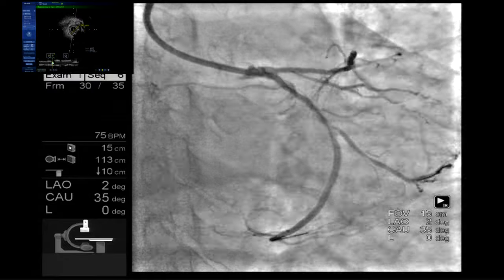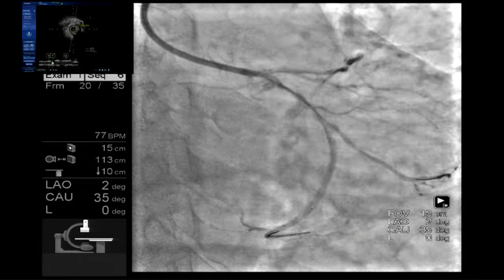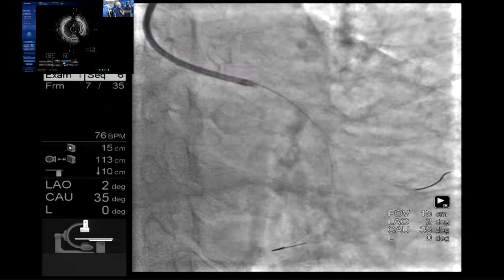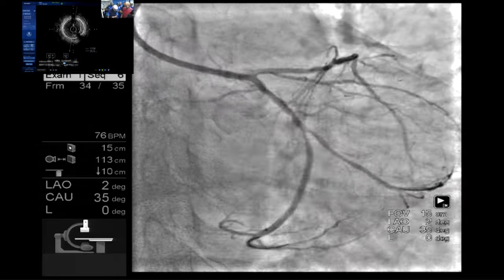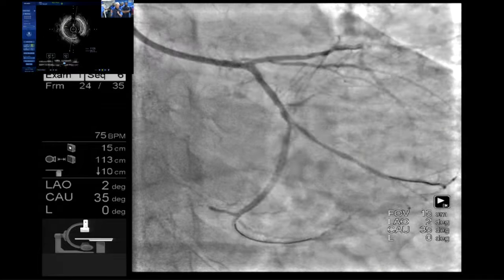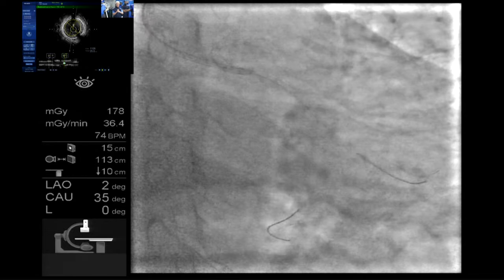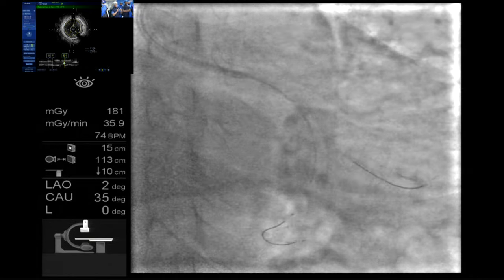EM, right. Would you start with a 2.25 because the rule is to go a quarter size down? Quarter size down, yes. We got to follow the rules, right? I have to keep you in line, you know? Oh, my God. I think it's 2.5 here. I think 2.5 will be okay. Yeah, 2.5 is okay. So low pressure dilatation to cover the distal dissection and dilate much bigger in the proximal site.